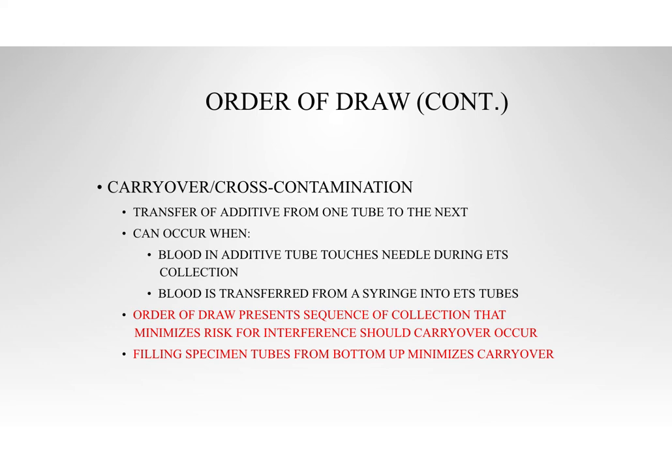Contamination can happen also when blood is transferred from a syringe into the ETS tubes. So again, the order of draw has been found to minimize the risk of interference, okay? Also, we need to fill the specimen tubes from the bottom up to minimize carryover.